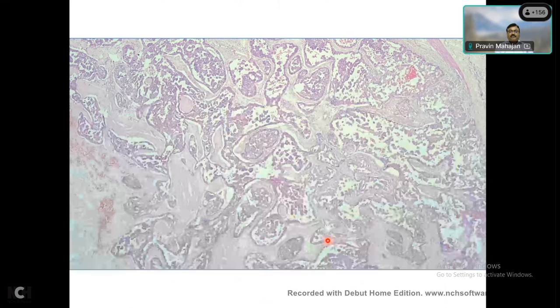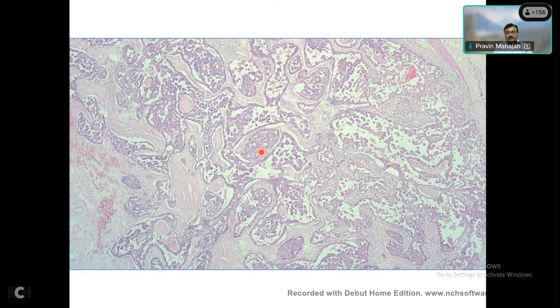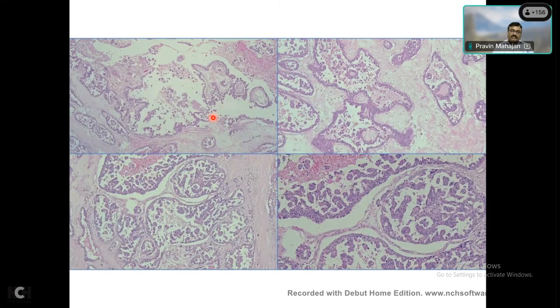Now this is an example of invasive papillary carcinoma. You can make out a very irregular pattern of infiltration within the stroma. The stroma is very fibrous, so there is a stromal reaction also. On higher power, you see broad papillae as well as some very slender looking papillae, and the nuclear grade is very high. So this is a tumor with high nuclear grade, widely infiltrating into the stroma. So it is an invasive papillary carcinoma of the breast.